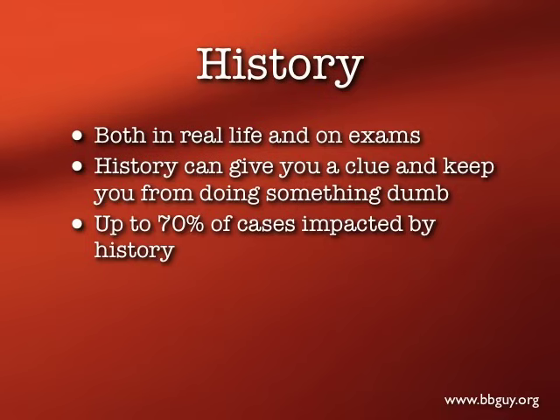The fact that we need to check the history is true both in real life and on exams. History can really keep you out of doing something silly. And there's a wide variety of things. We'll talk about some of those on the next slide. But up to 70% of cases, according to some studies, are impacted. Your approach and your interpretation are impacted by what you read in the history. So don't just skim over it. Look for clues, especially on exams. Sometimes they give stuff away.